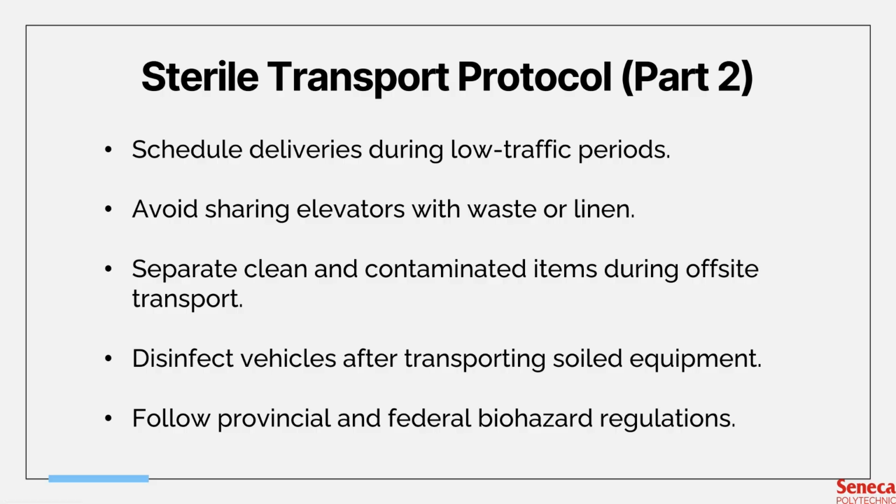When transporting off-site, you have to separate clean and contaminated items completely. There are actually some companies whose main service is to sterilize instruments. One example is Sterile, and I urge you guys to search this up. They transport off-site, meaning they will have clients, either clinics or hospitals and other healthcare facilities. They would be sent dirty instruments, and it's their job to clean them for their clients and then send them to their clients in a timely and clean manner.